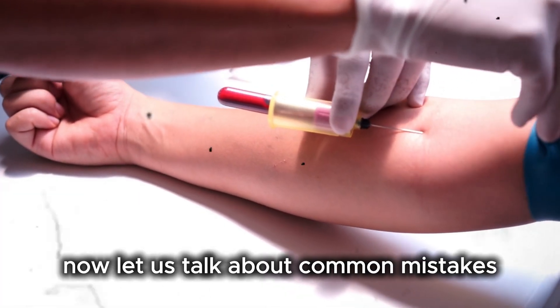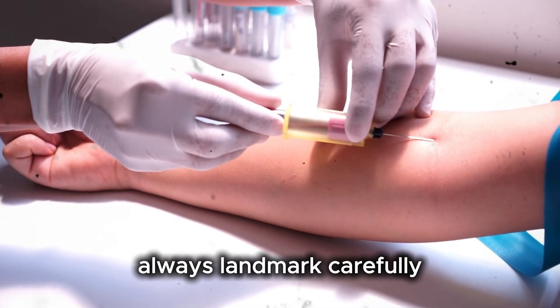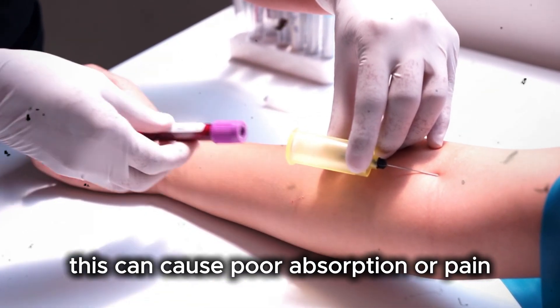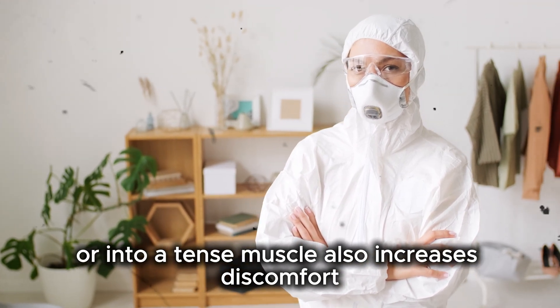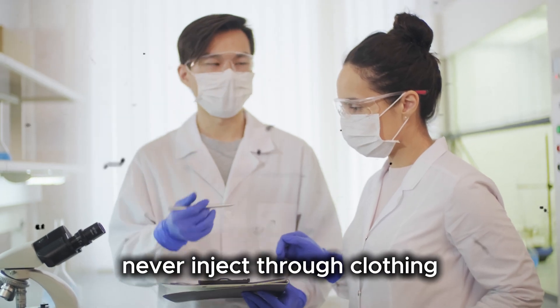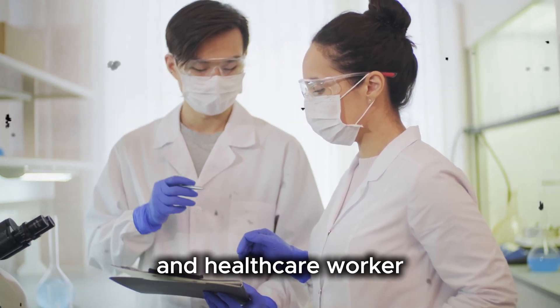Now let us talk about common mistakes and how to avoid them. One common mistake is incorrect site selection — always landmark carefully. Another mistake is using the wrong needle size, which can cause poor absorption or pain. Injecting too fast or into a tense muscle also increases discomfort, so always encourage relaxation. Never reuse needles or syringes, never inject through clothing, and never skip hand hygiene. These basic rules protect both patient and healthcare worker.